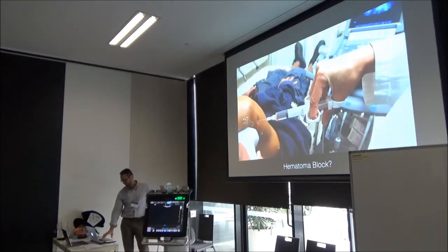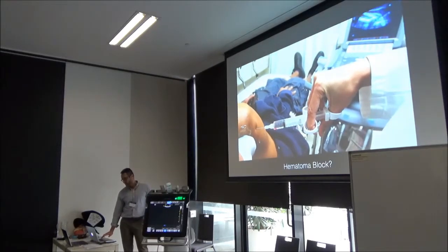So who recognizes the fatal flaw in this video? No aseptic technique. Yeah, she should wear a glove, right? I mean, it's like not even like not in India, right? This is not in Bangalore. I was like, oh my God, put a glove on your hand before you do a block. So other than the non-glove part, she was okay.